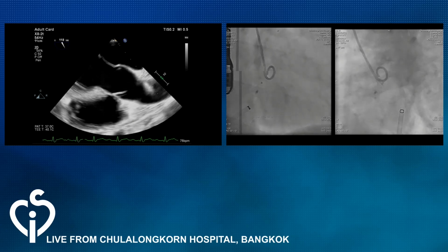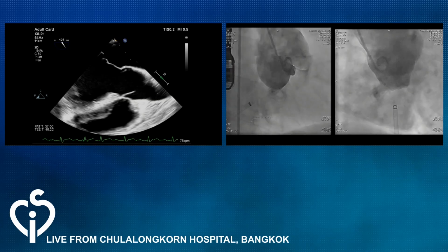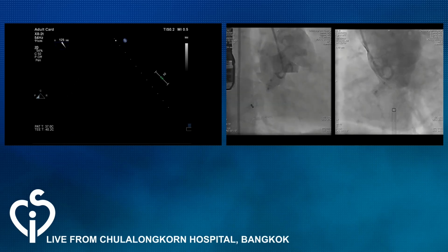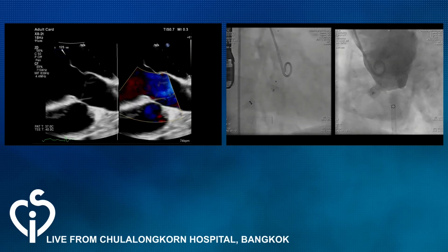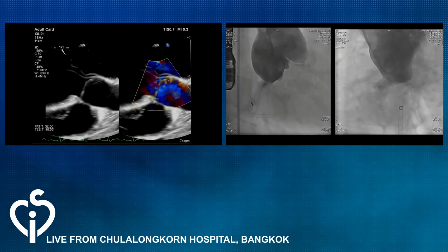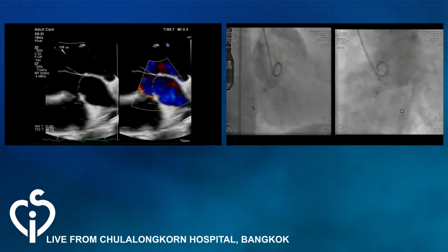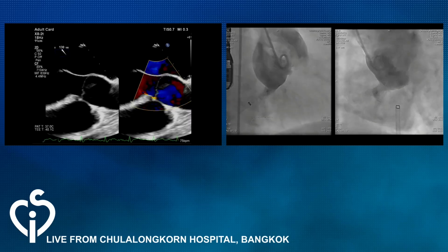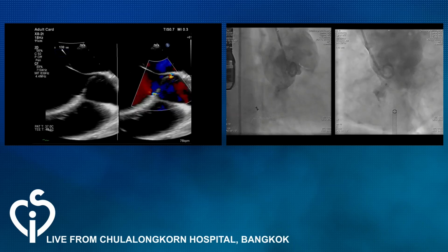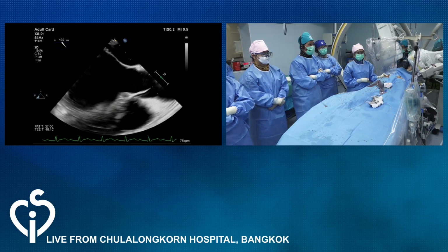A little bit more comment about the disc. I think my purpose is to have the disc closing the aortic orifice completely, and the tunnel of the defect is not like a circle, so the device will need some time to expand gradually to close the tunnel. So I think it should be closed in 1 or 2 days, or maybe 1 week or 1 month.